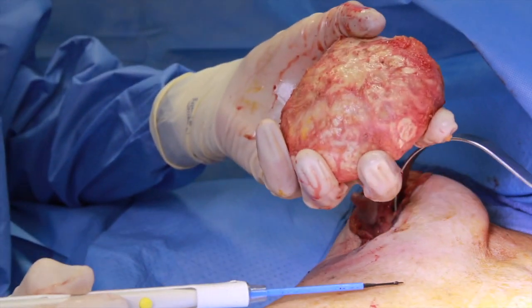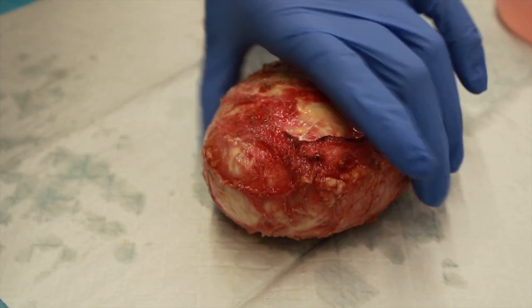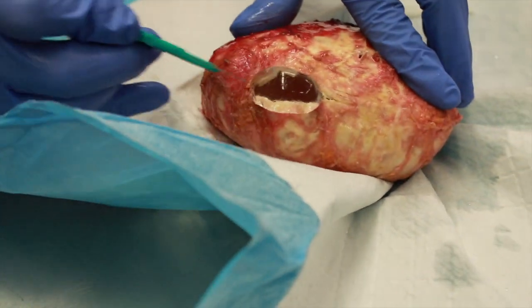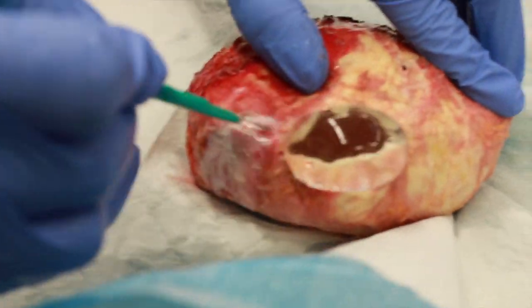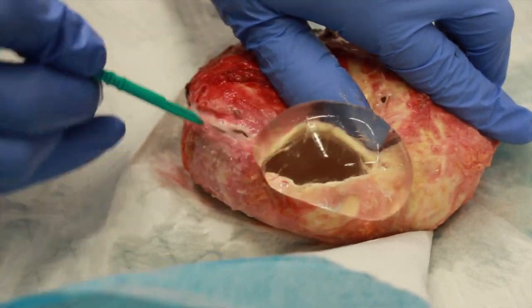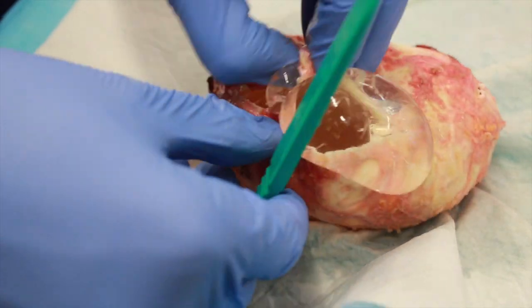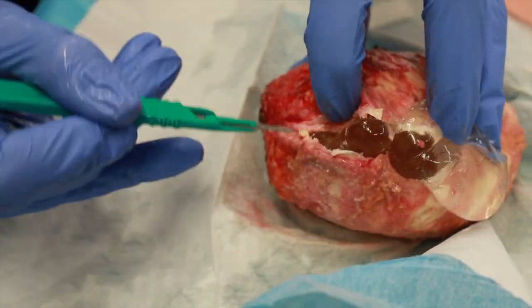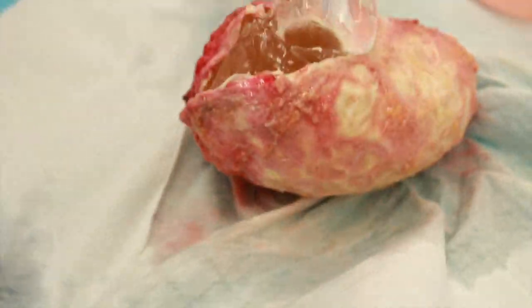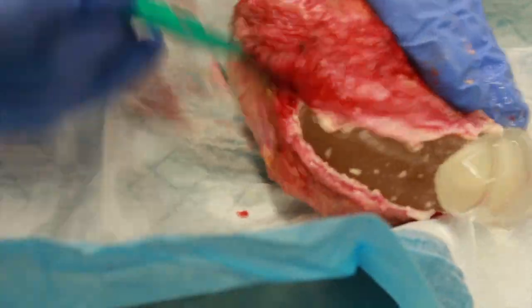It's a boy! You can see how rock hard this implant is. These calcifications show up after the implant has been in about 20 years, not sooner than that, and that's why we recommend that implants be changed every 20 years. We're having a difficult time opening this — we're doing this on the back table after the operation just to see what's in there. These are not our surgical gloves; we don't want to get this mess into the field. But this is a very, very thick calcified capsule — it's like an eggshell.